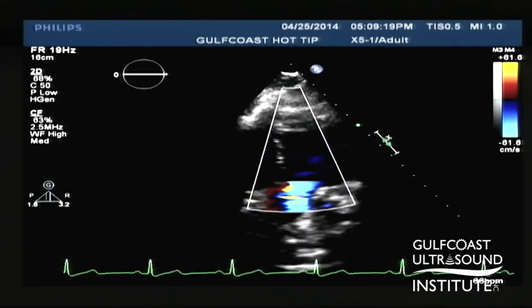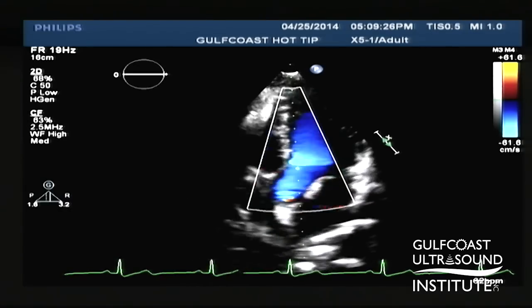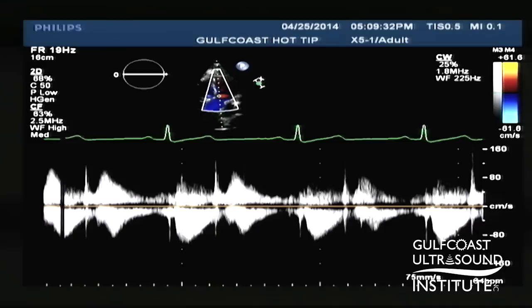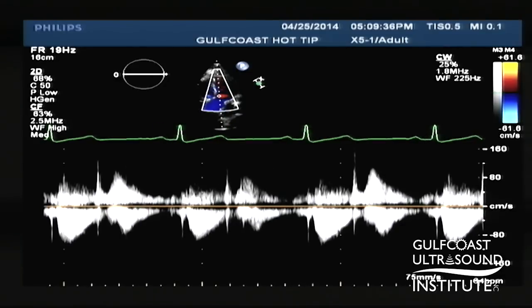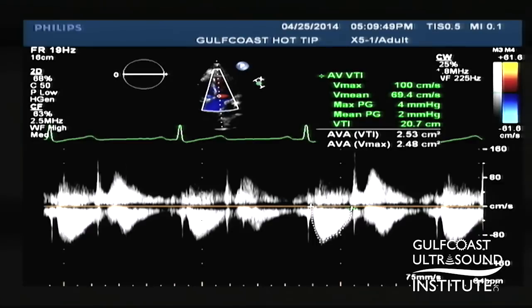The last thing we're going to do to get the aortic valve area is do continuous wave Doppler right through the aortic valve. We're going to freeze the image and CineLoop through it, and then trace the envelope so we can get our VTIs. When I'm done tracing this envelope, the aortic valve area is going to pop up because I did all three steps. I have an aortic valve area VTI, and also an aortic valve area calculated using the maximum velocities. And that's how you calculate an aortic valve area using the continuity equation — three simple, easy steps.